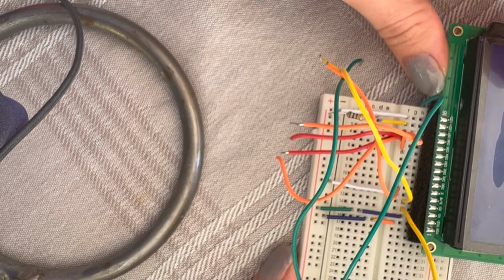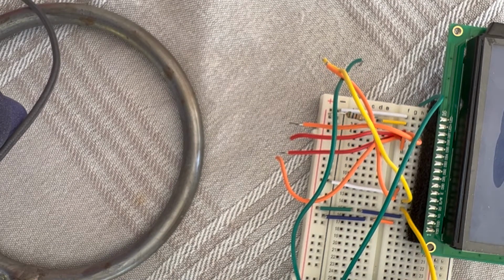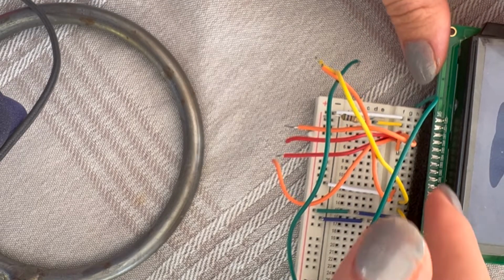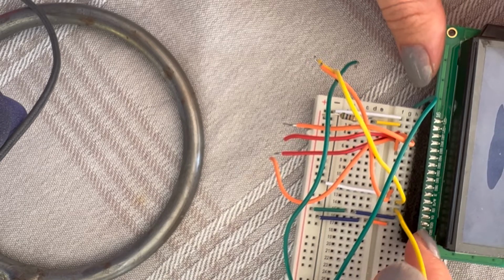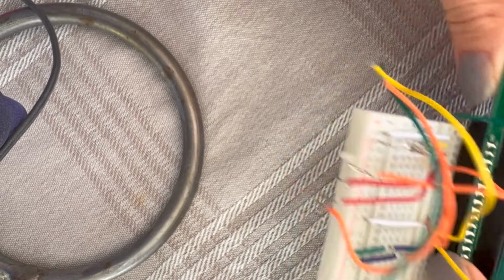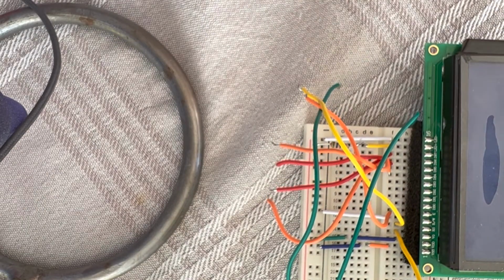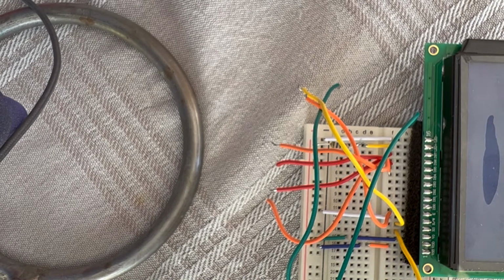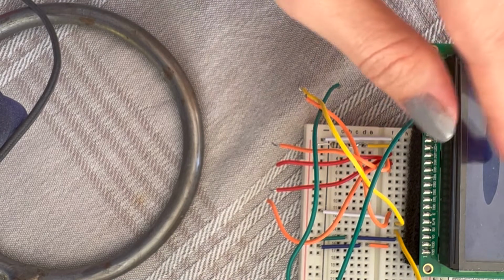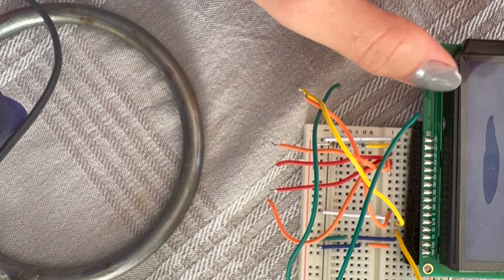Maybe I should remove everything, or let's keep it. It was really time consuming to reconnect everything, but I explain it this way. So the LCD has 16 pins, one is here and 16 is at the other side. This LCD has the pins connected, but if your LCD has no pins, you can use these ones to put it on the breadboard and put the LCD on top of it. But again, you need to make it stable so that it doesn't move.